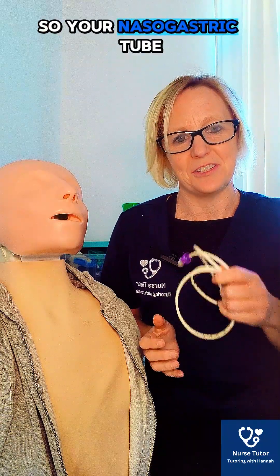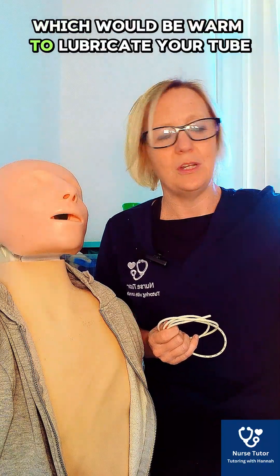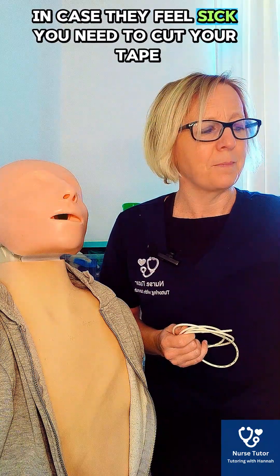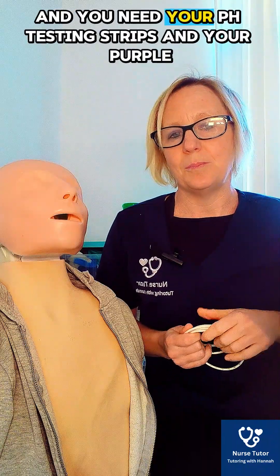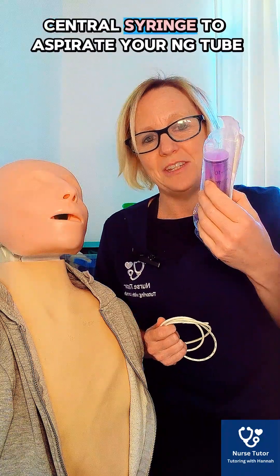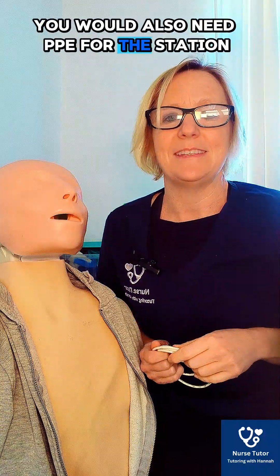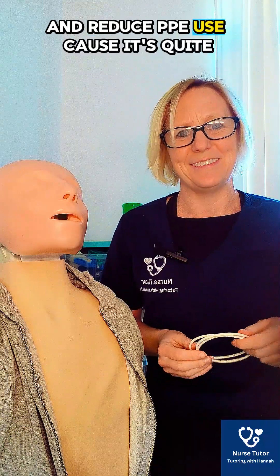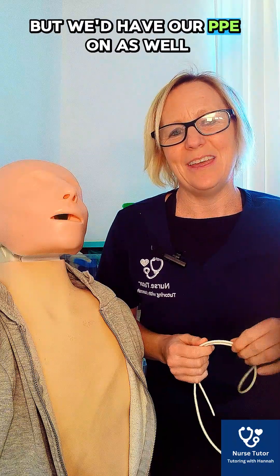You would have gathered your equipment: your nasogastric tube, sterile warm water to lubricate the tube, and a receptacle to give to the patient in case they feel sick. You'd need to cut your tape — two pieces to secure the tube — and you need your pH testing strips and your purple enteral syringe to aspirate the NG tube and check position. You'd also need PPE — gloves and apron.